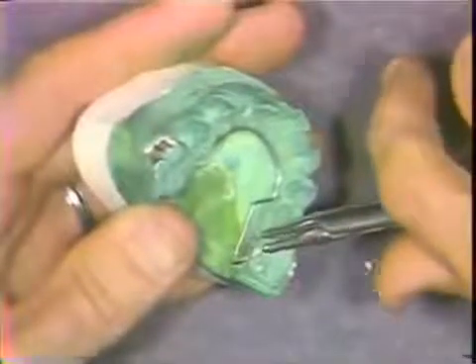The two ends are grasped in the plier beak, and a conventional twist is made with the end of it just above the mesial portion.